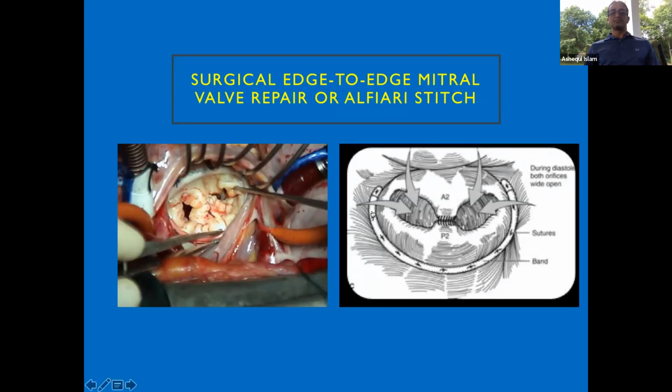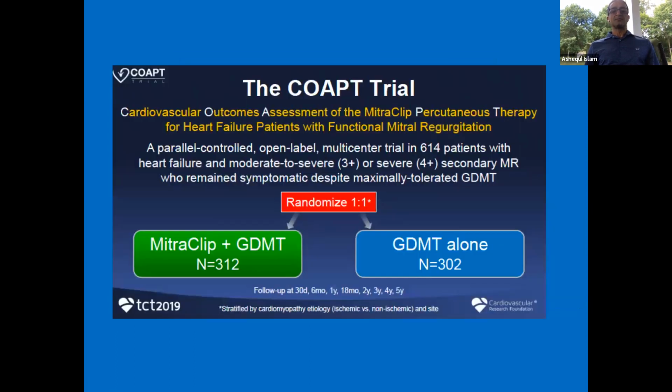Of course, the annuloplasty ring is very common for mitral valve repair by cardiac surgery, but Alfieri's technique started the whole concept of MitraClip, which is a transcatheter technique.